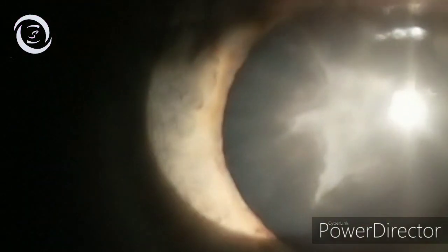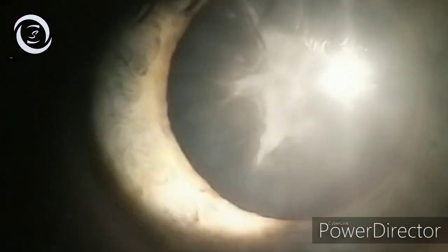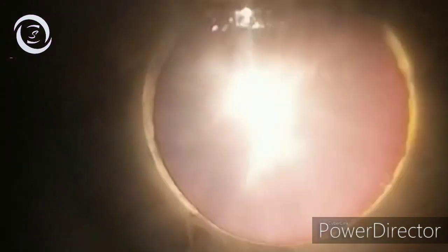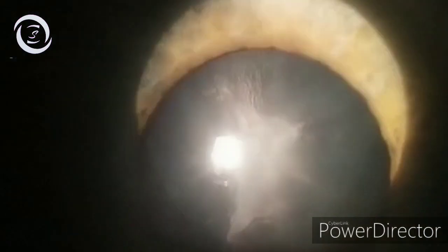I am Dr. Sharjeeel, and today I am presenting a 20-year-old male patient. He had a history of blunt trauma to the eye, following which he had decreased vision in one eye. On slit lamp examination, I found this star-shaped, flower-like anterior capsular opacity. So I diagnosed him as a case of rosette-shaped cataract, or stellate-shaped cataract.